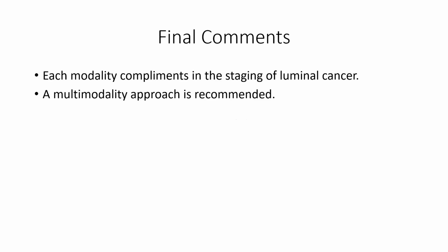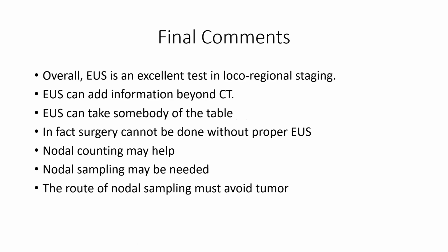So coming to the final part of my talk, each modality complements the staging of luminal cancer. A multimodality approach is recommended. If it is your own relative, you want as many modalities to give you as much information before selecting the therapy. Overall, EUS is an excellent test in local regional staging. It can add information beyond CT. When it comes to nodes, CT may not pick up sub-centimeter nodes, and some of the nodes we have shown are sub-centimeter nodes, which have been picked up by endoscopic ultrasound.